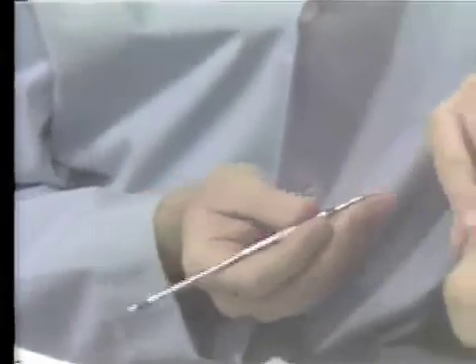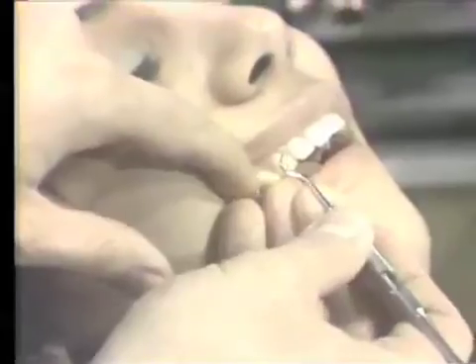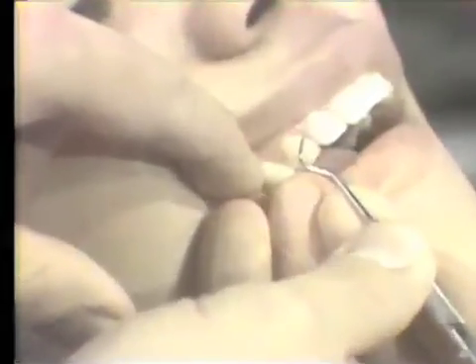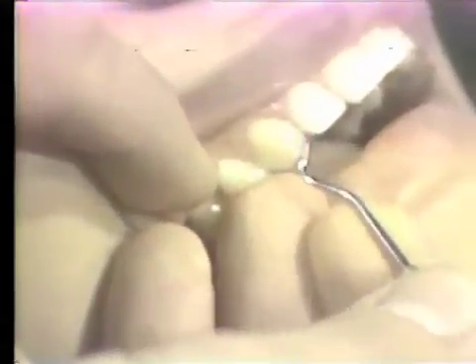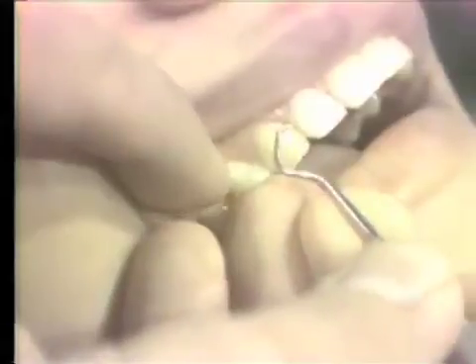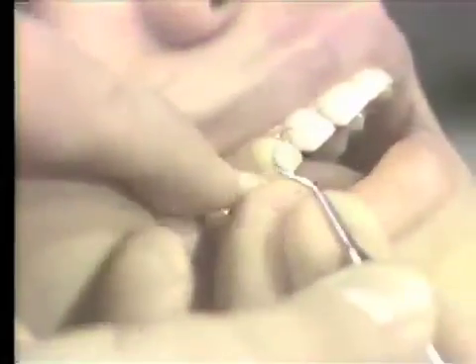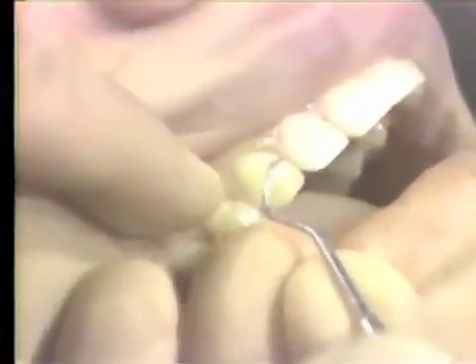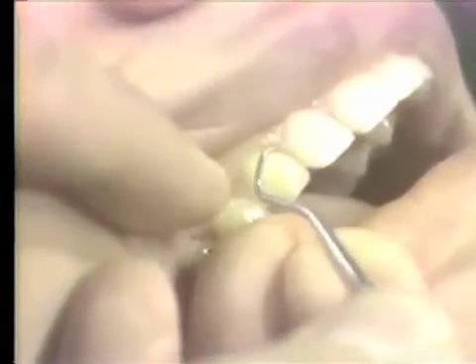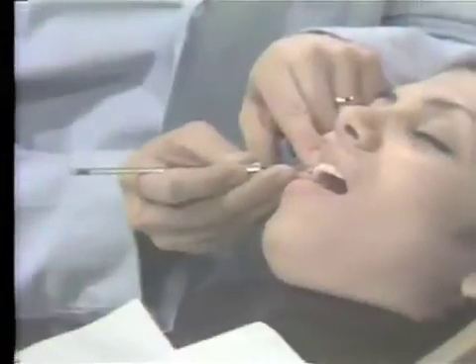When the exploring stroke is used in the mouth, the instrument is placed like so. When using the exploring stroke with a scaler, there is slightly more finger used than when using the scaler in the working stroke. Now let me demonstrate the difference between the exploring and the working stroke. When using the exploring stroke, the scaler is inserted like so. When the working stroke is to be used, the scaler must be turned so that the face of the instrument is more at a 90-degree angle to the surface of the tooth.